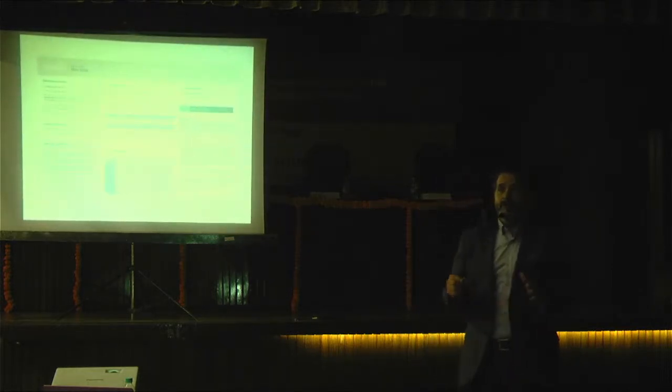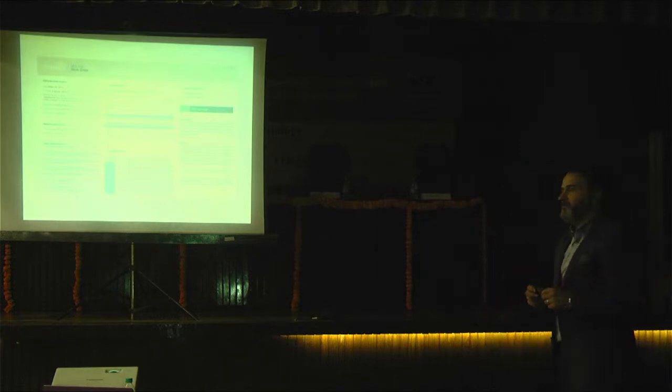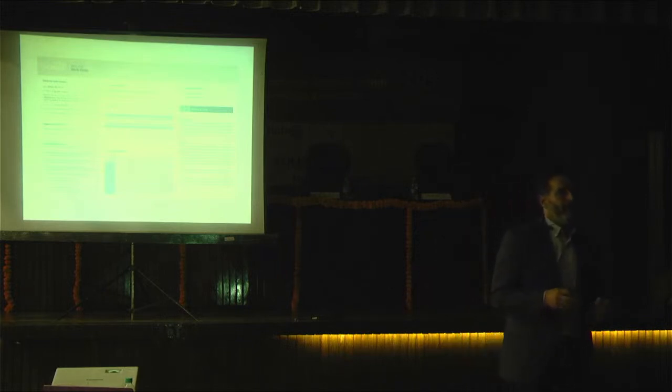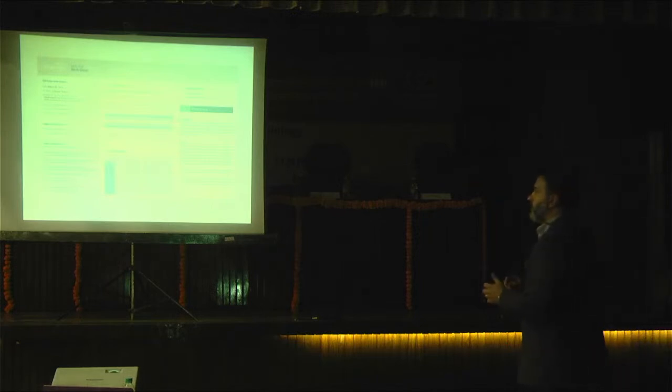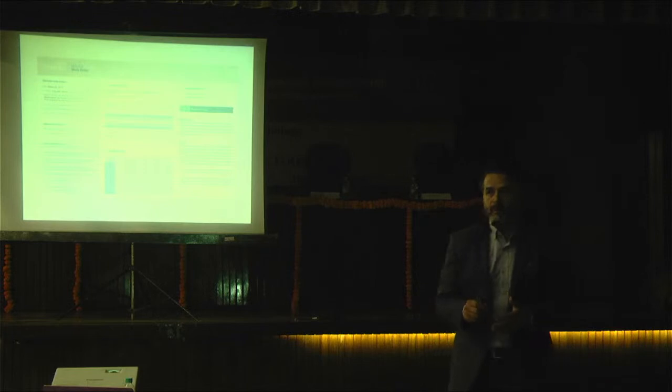So once you get the files, once you get your patient, and once he said yes, I want this surgery, after it, you fulfill a paper like this. This is what we call the work order form, which can be filled via internet.